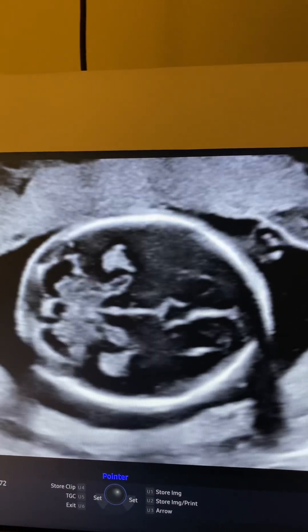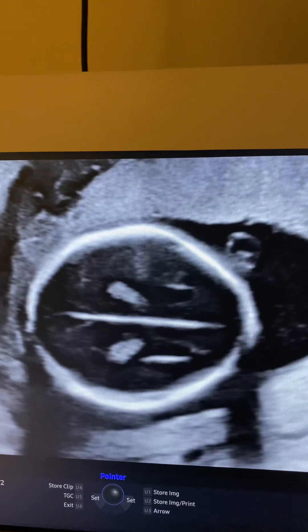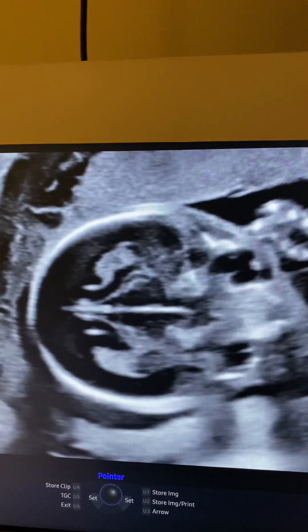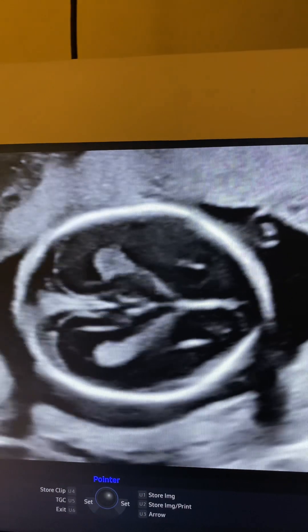Hey guys, today I am just going to show you how to go from your head circumference view into the posterior fossa view to get your cerebellum, cisterna magna, nuchal fold, and also to get your orbits view.